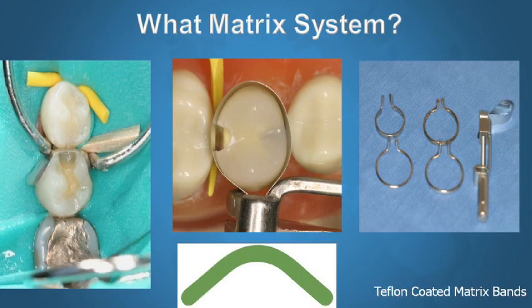After having a properly isolated field, then we're going to use our matrix band. Tofflemire matrix bands are pretty much a thing of the past. I mean, I almost don't see any need for them anymore.